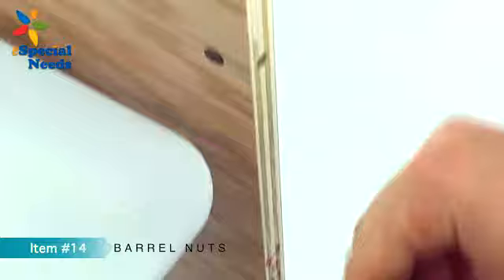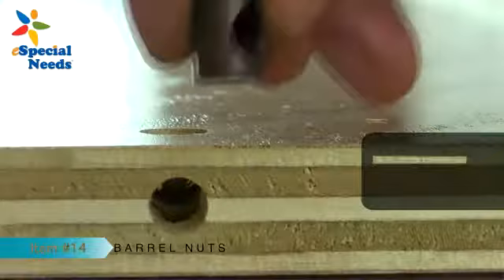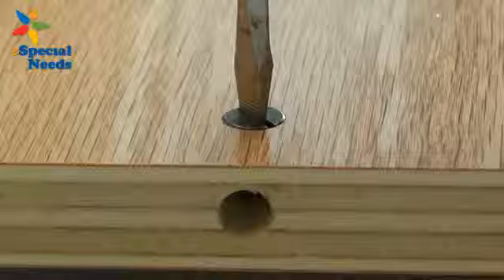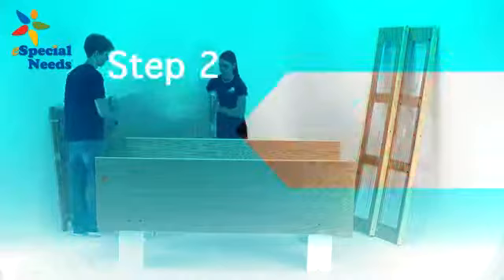Insert 12 barrel nuts, item number 14, into the holes in each of the ends of the side panels. Be sure to align the barrel nut slot perpendicular to the edge of the panel. You may want to use a flathead screwdriver to help with the alignment.